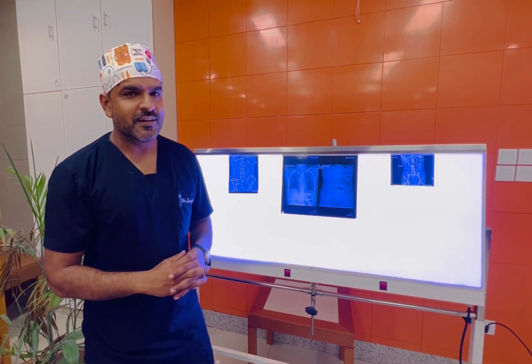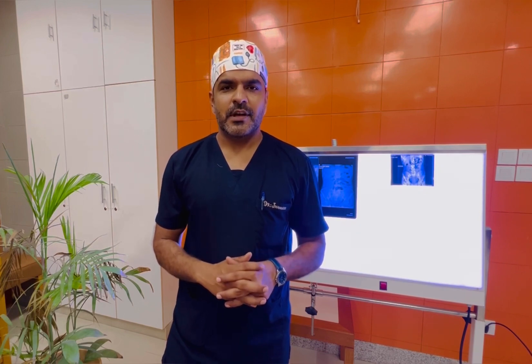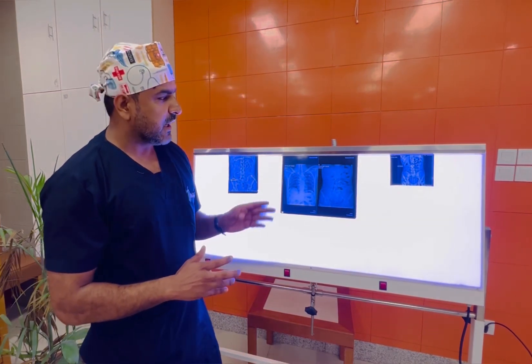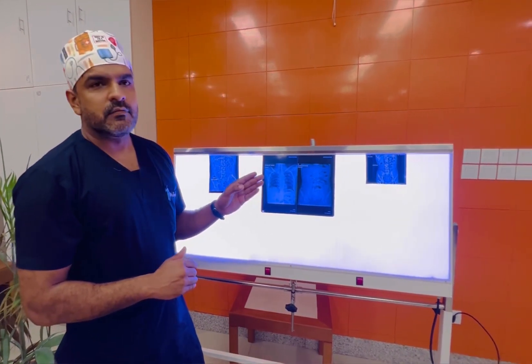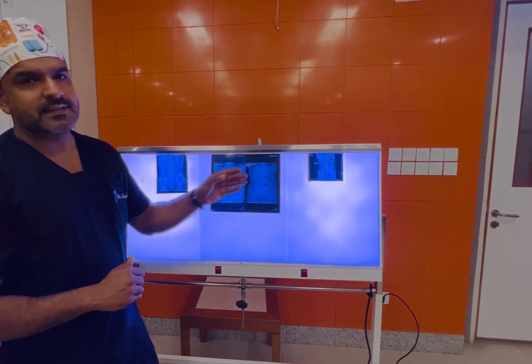Today we will discuss one of the most important topics: abdominal X-ray. It is a much needed topic for every final year student, house officer, postgraduate, and even the general surgeon. We will discuss briefly the X-ray abdomen — we will cover erect and supine X-rays.